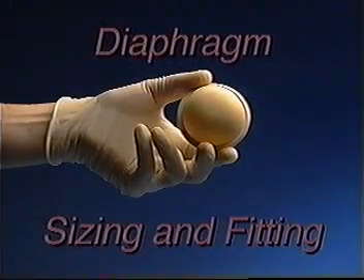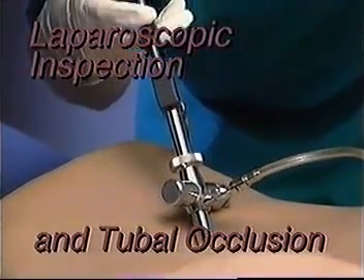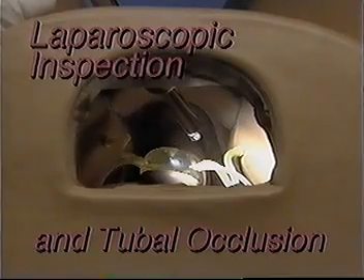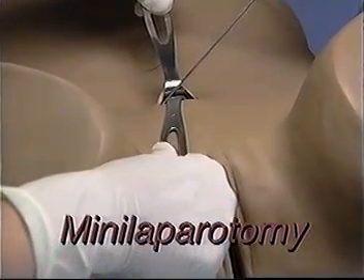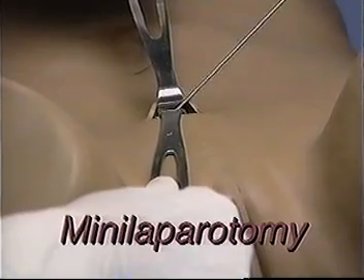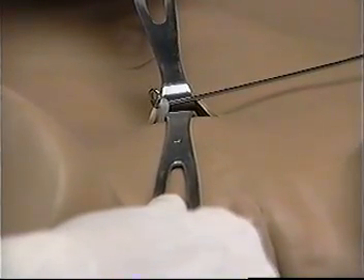Diaphragm sizing and fitting. Laparoscopic inspection and tubal occlusion using Falope rings or other clips through the incision just below the umbilicus. And finally, mini-laparotomy — both interval through the incision above the symphysis pubis and postpartum through the incision below the umbilicus.